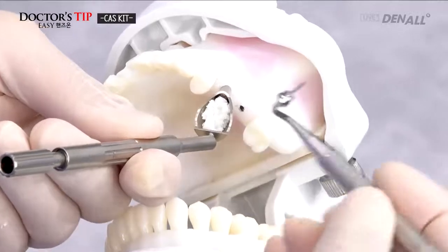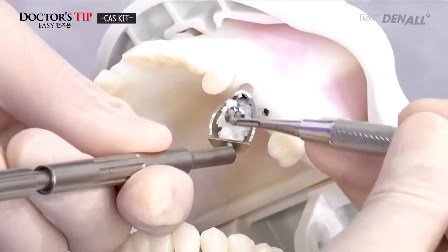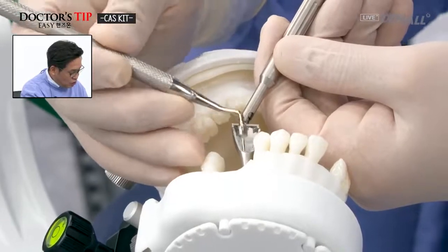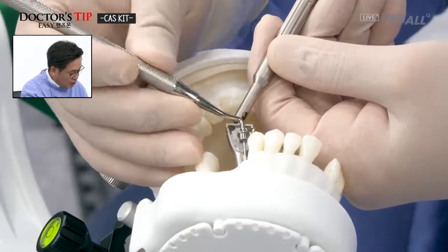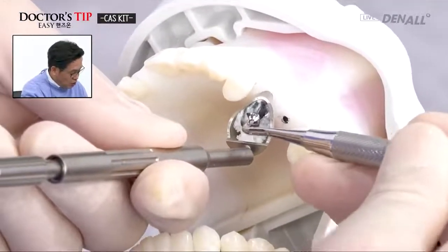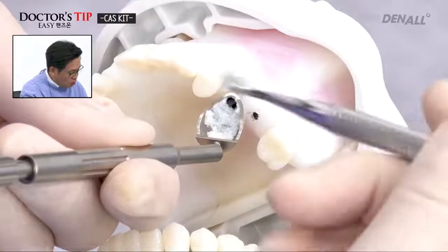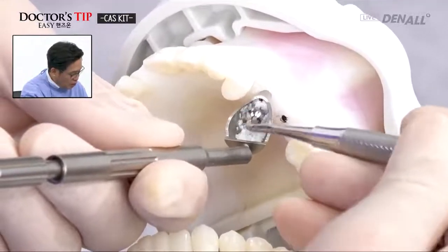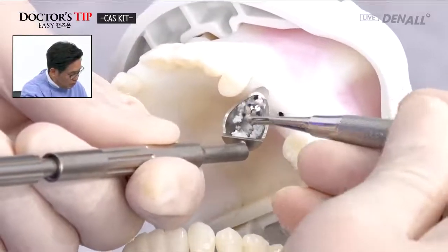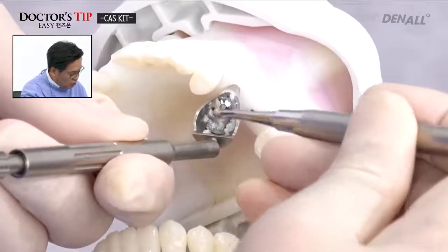Sufficient bone graft material is inserted using the bone condenser. This is pushed in. A 1.1 millimeter diameter is used, so no blockage will be made. A 2.0 diameter condenser is used to insert more quantity of the material without encountering blockage. Using the bone condenser, the graft materials are inserted.